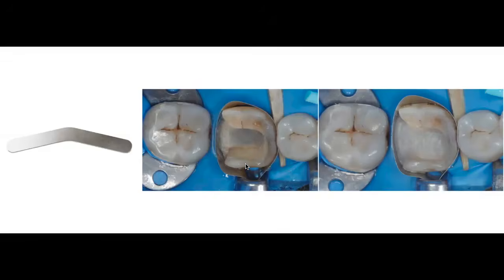Now, in this particular case, I did not have to modify the band at all. I was able to push the band apically, and as you can see in the photo on the left-hand side, sink it enough to have complete control of that mesial proximal box, the deep box that you see there. And then using composite resin, I was able to elevate that deep margin using this simplified technique. Now, this is easy in some cases, but it's not usable in every case out there.